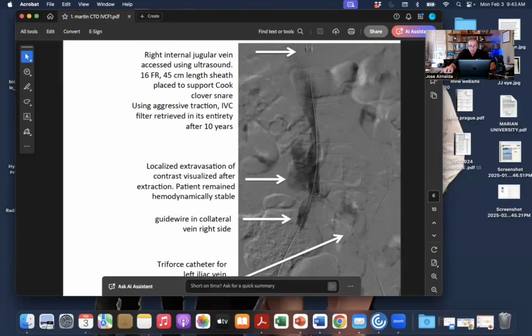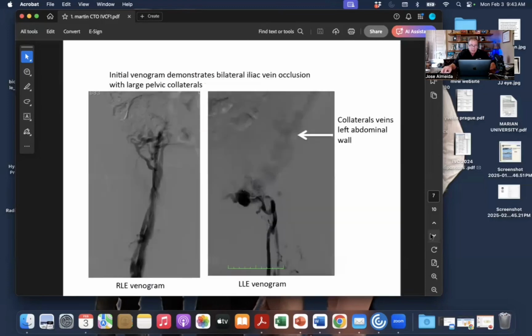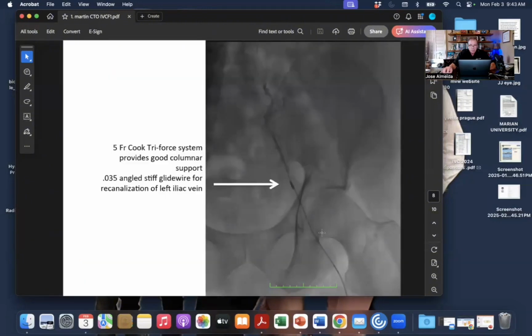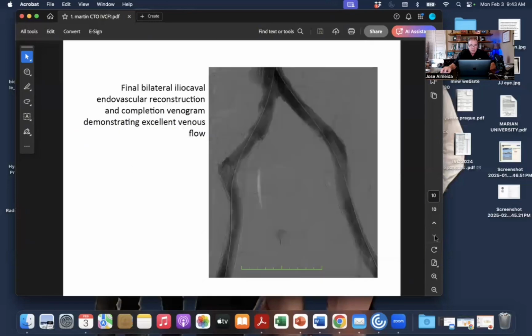You can see from below with the Triforce catheters, we were able to cross the iliac vein occlusions. And here's the right venogram, occlusion above, left venogram, occlusion above, and Triforce catheter recanalizing, and bilateral balloon angioplasty, kissing balloons, and bilateral iliac vein stents were placed with pretty good flow.